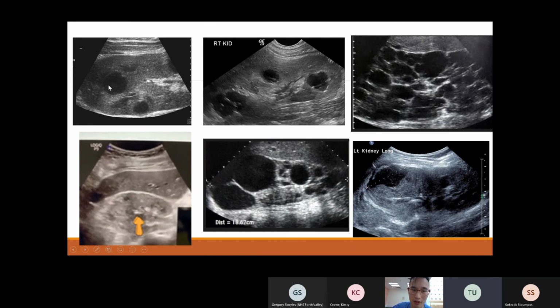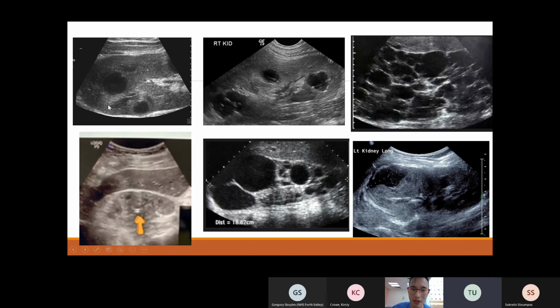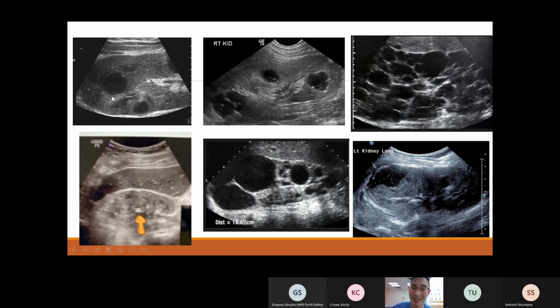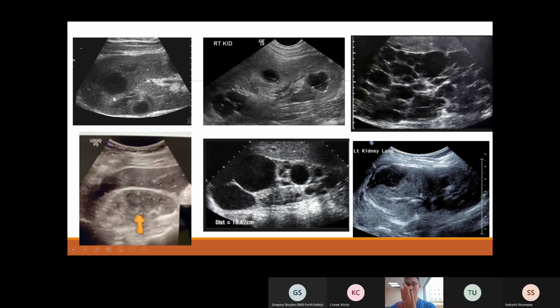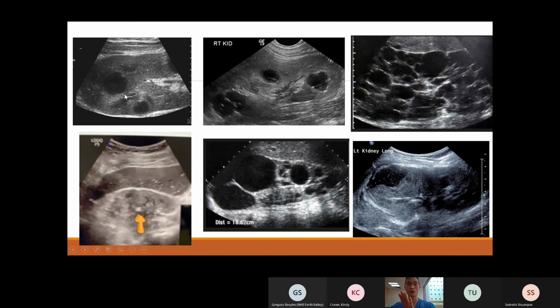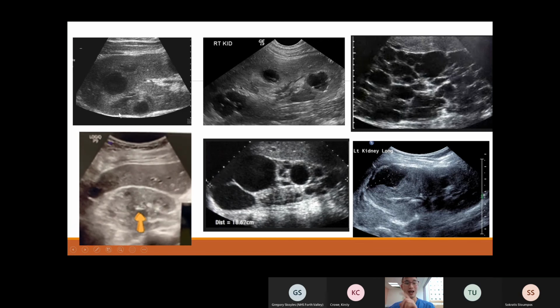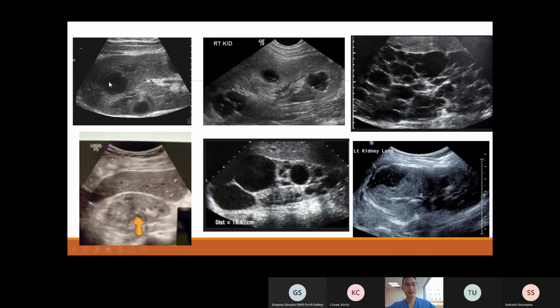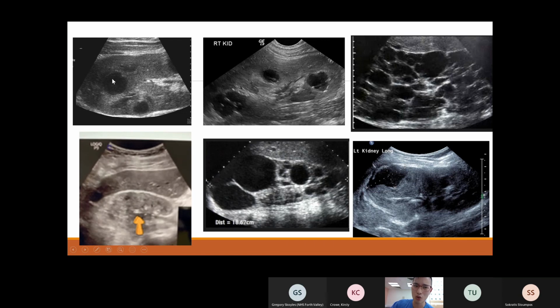And what's the other thing? Hypoechoic. I'm not sure. So you have the acoustic enhancement. Shadow, yeah. Enhancement. No, not shadow. Shadow is different. Shadow will tell you that there is a very dense structure above and ultrasound is not going through. So the shadow is not fluid. If it's acoustic enhancement, that means it's fluid. Yes. Okay. You're absolutely right, a fluid-filled structure.